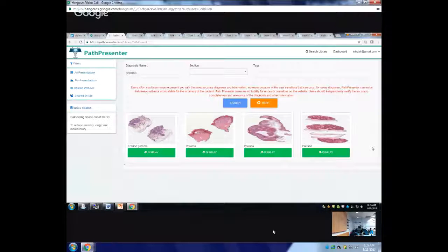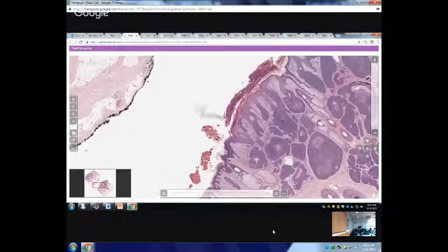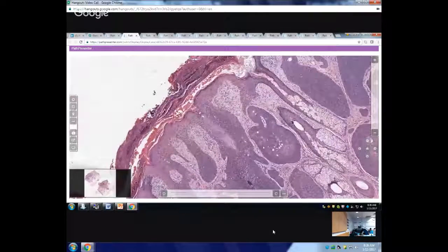And then you just look at all the slides. If you have your book with you, you open up your book and then you just display the slide. You can do this on your iPad, on your phone, whatever you want. And the only way is read and look at the slide, read and look at the slide. Try to match the features actually.